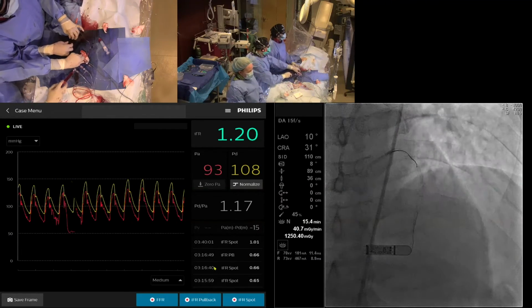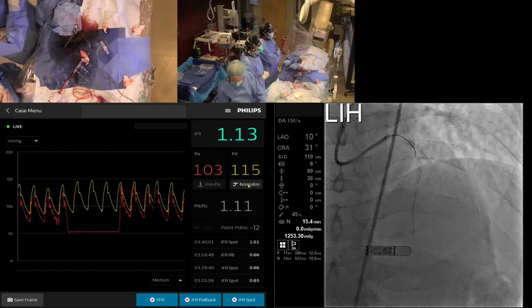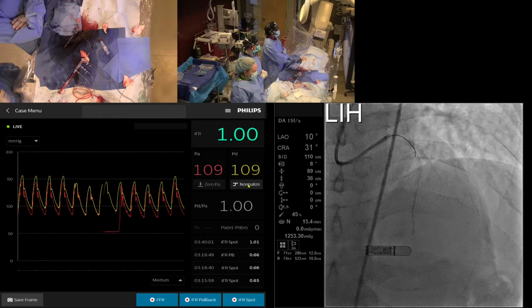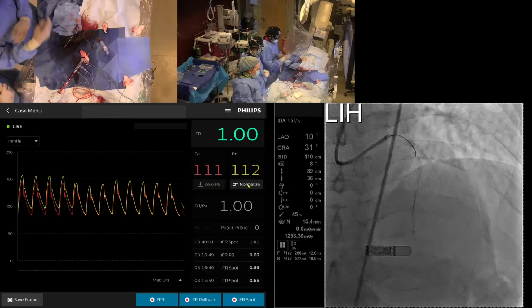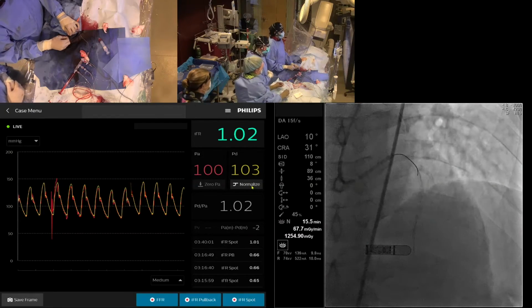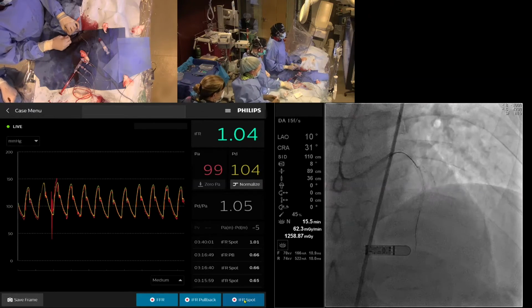Okay, now I'm just going to disengage here. Okay, you want to equalize? Can we normalize here, please? Yeah. My only concern, to be honest with you, at this point is that the wire is losing its equalization a little bit too fast. Hopefully it won't happen, but my recommendation is you cross fast. I'll try. You want the torquer? No.